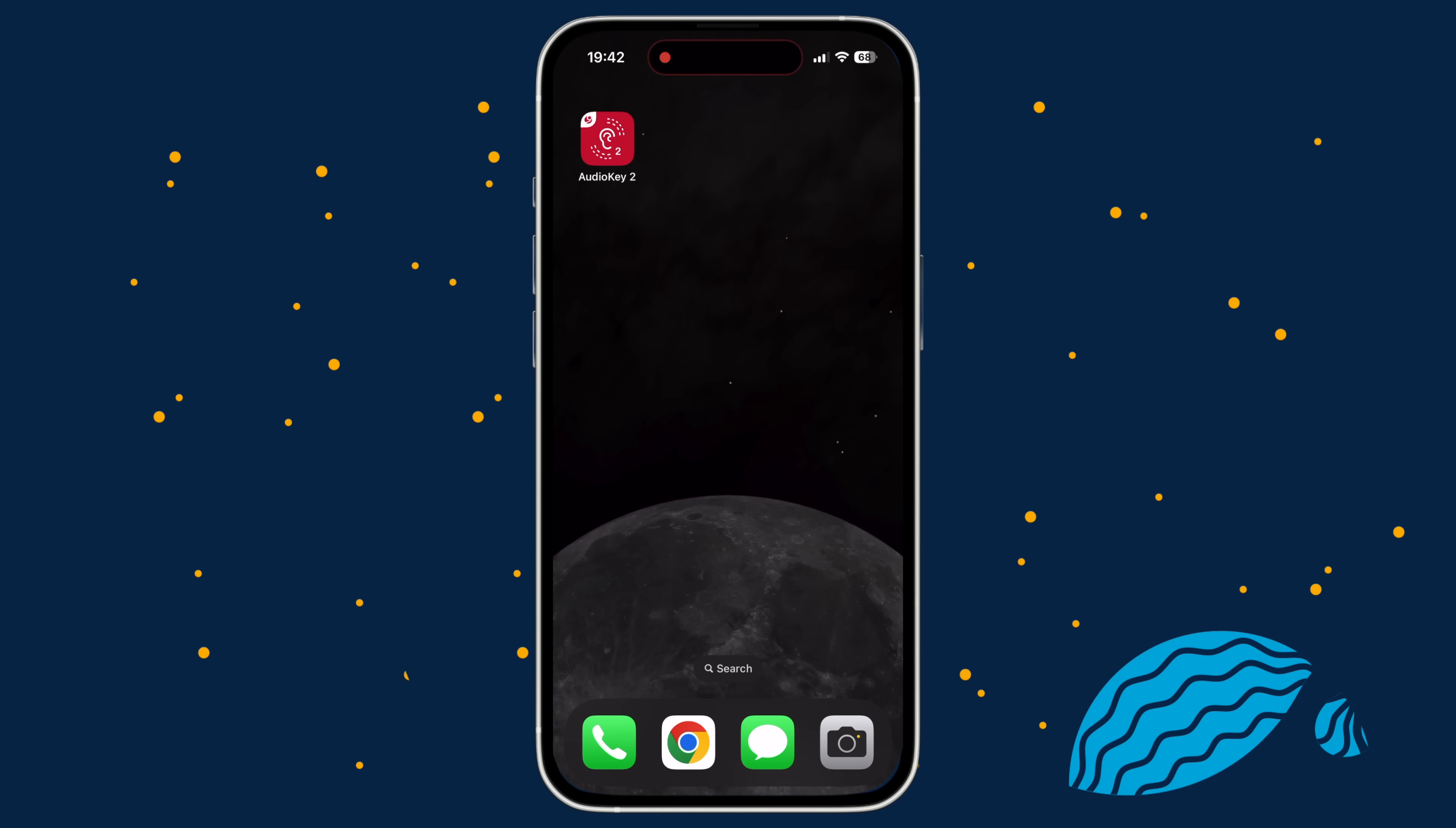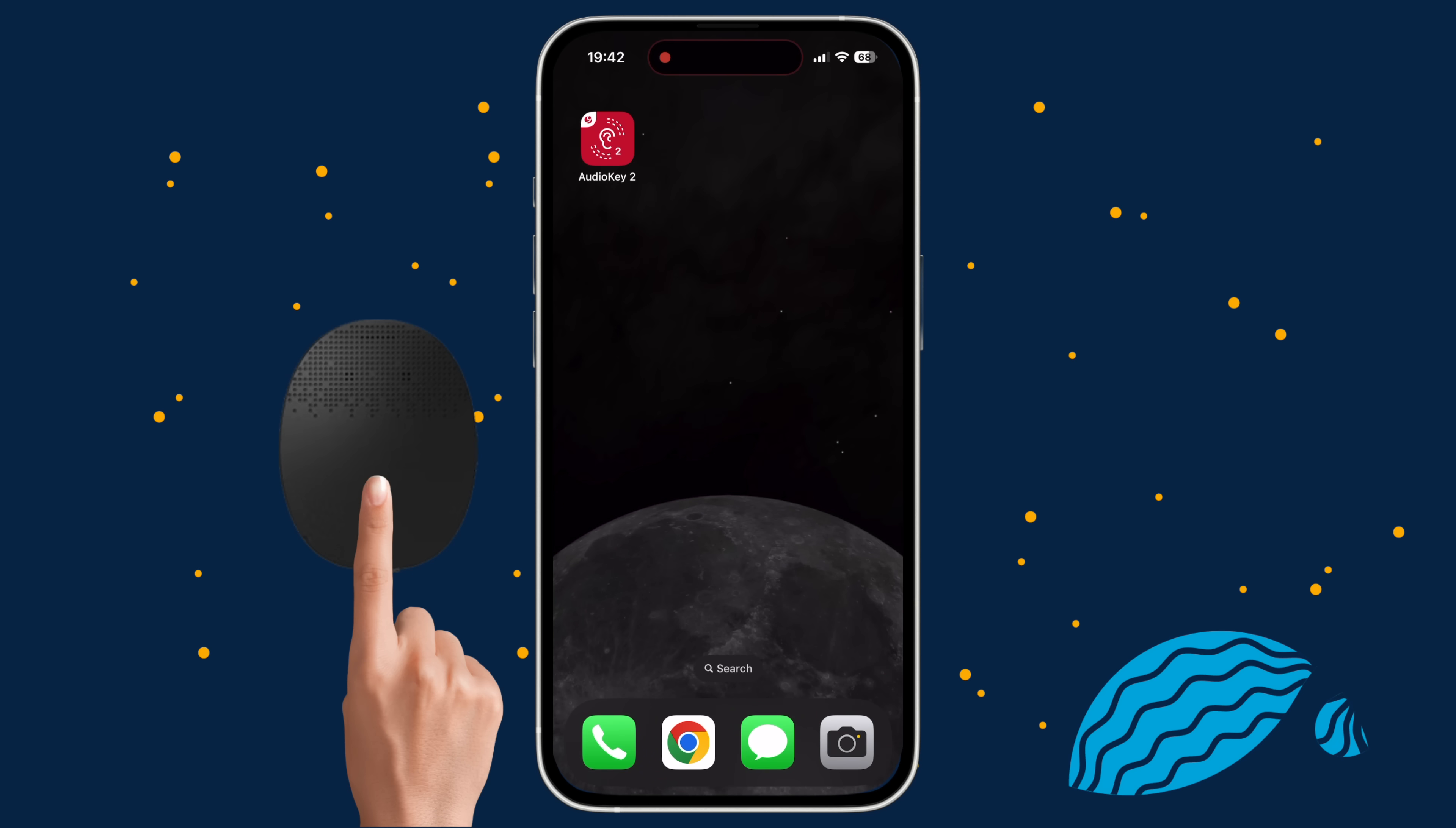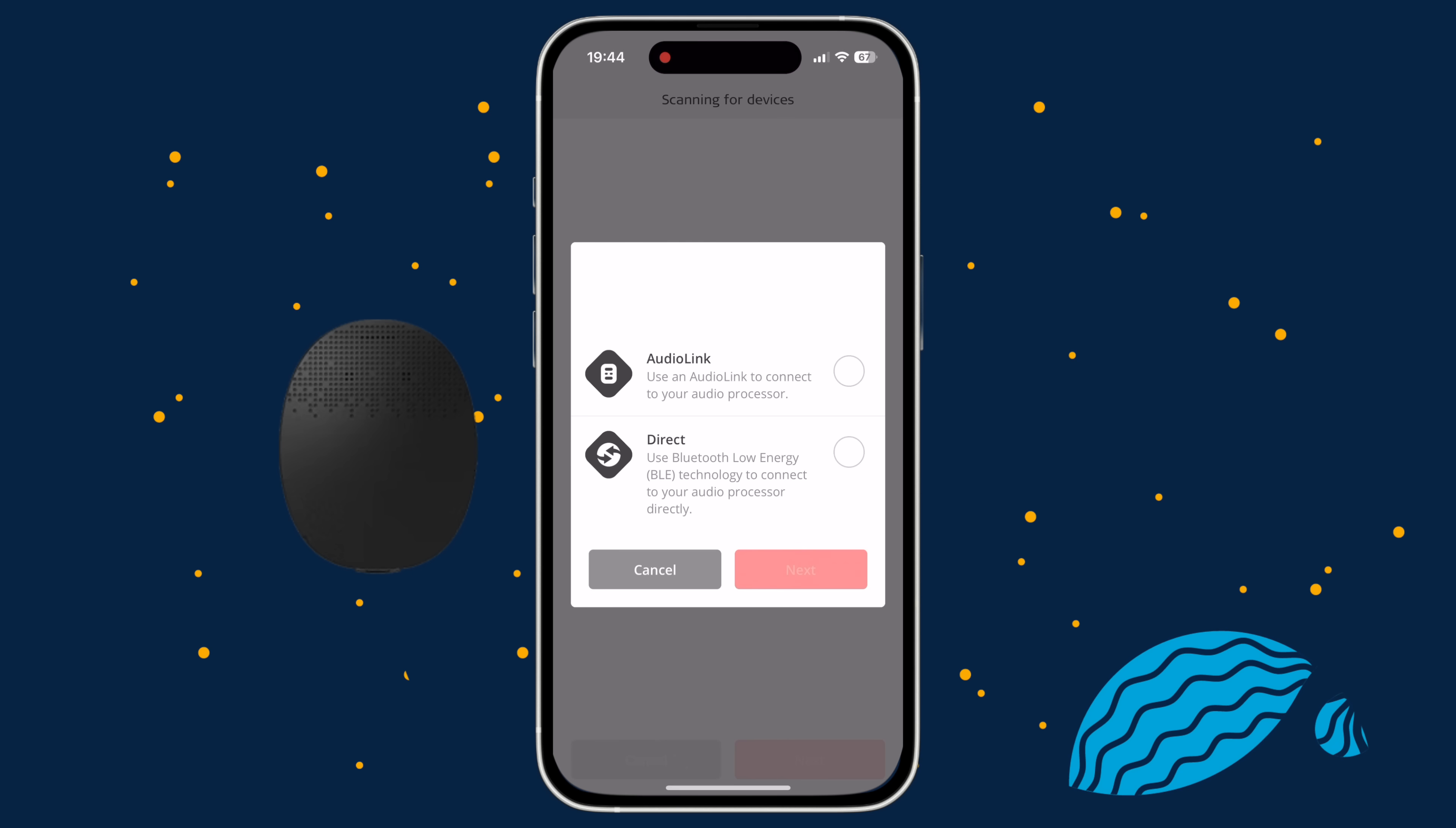If you are using Audio Key 2 with Rondo 3 for the first time, make sure that you have Bluetooth enabled on your phone. Restart your Rondo 3 and position it close by. Open the Audio Key 2 app. The pairing screen should automatically appear. Then select the Direct Connection option and tap Next.